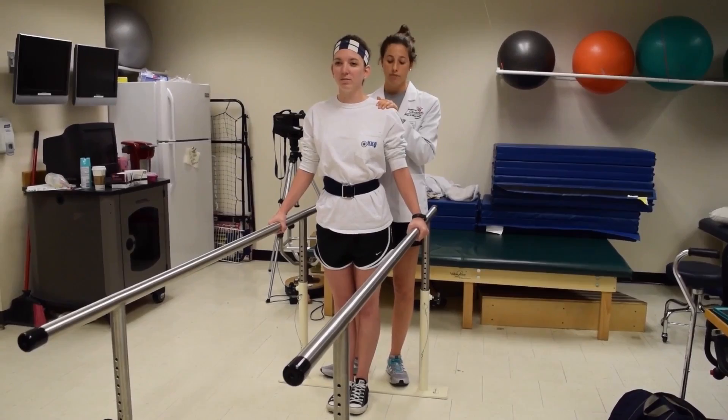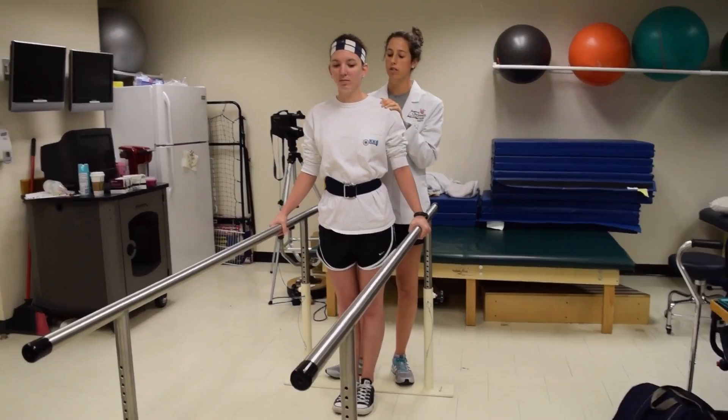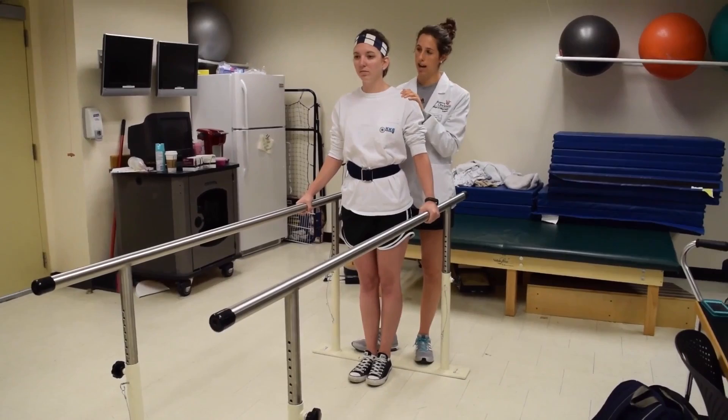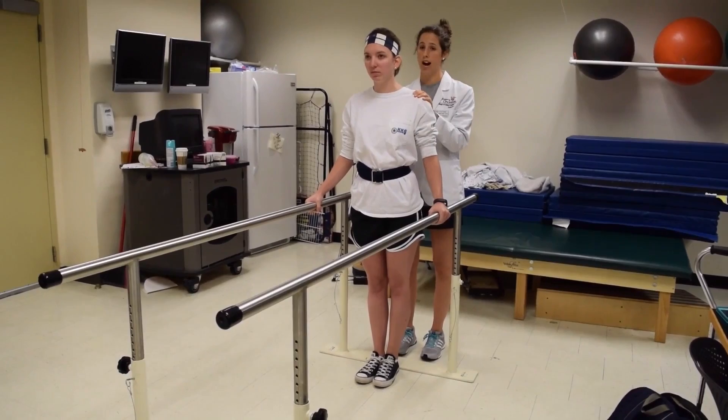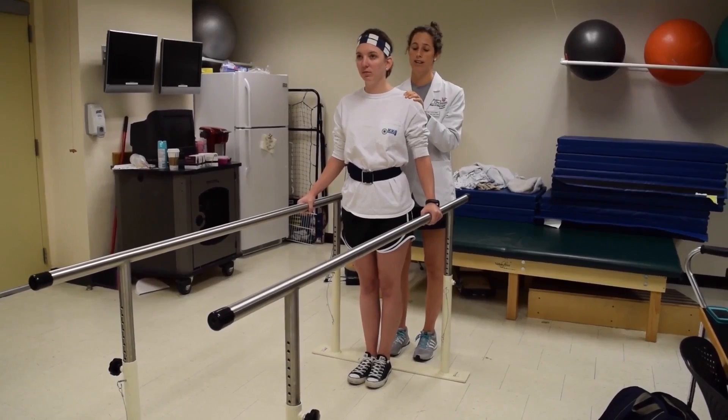The first thing we're going to do is just get Courtney used to having a little bit less stability than she has right now with these parallel bars. I'm going to be holding on to her the whole time, so she's perfectly safe. She is simply going to shift her weight to each side of her body and try to hold there for about five seconds. On the count of three, I'm going to have her shift to the left side.